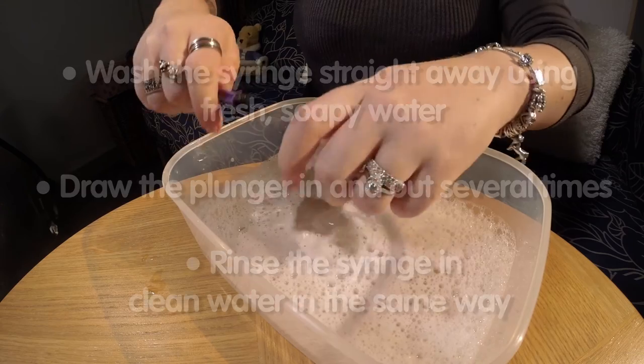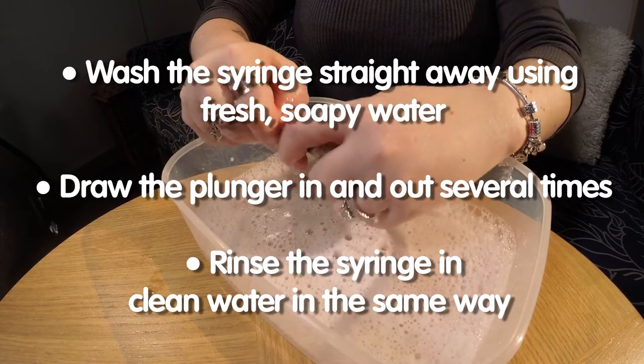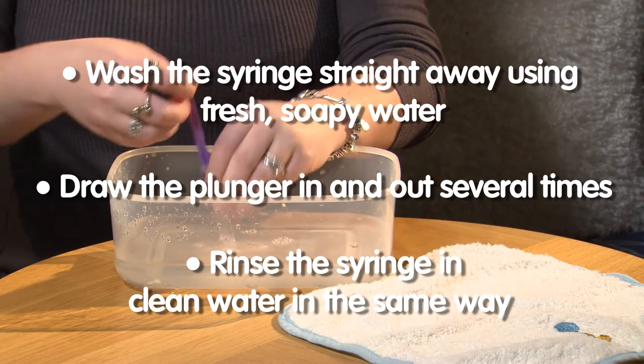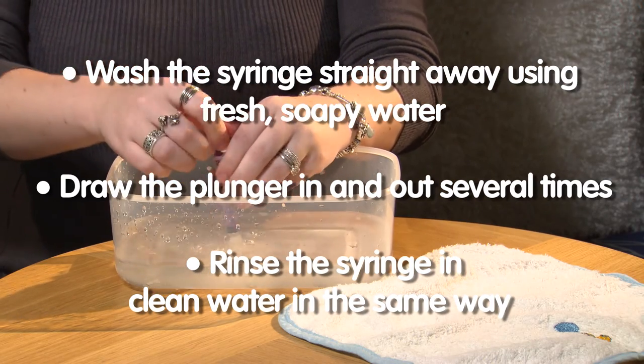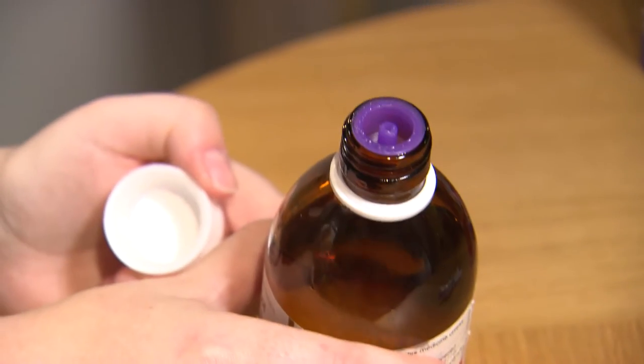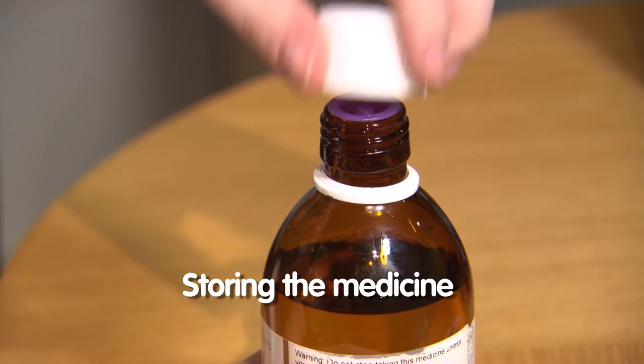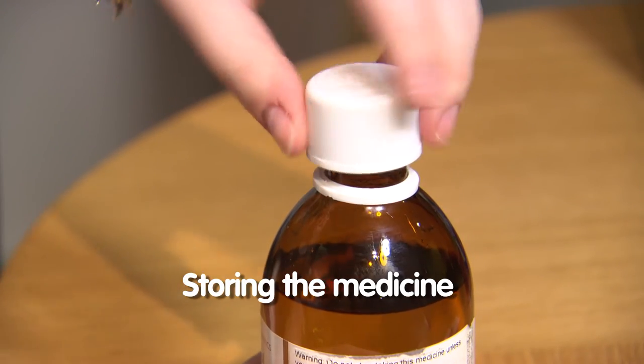Once you have given the dose, wash the syringe straight away using fresh soapy water. Draw the plunger in and out in the soapy water several times, then rinse the syringe in clean water in the same way. If the medicine bottle has a rubber bung you can usually keep it in the bottle all the time and put the cap over it between doses to keep it clean.